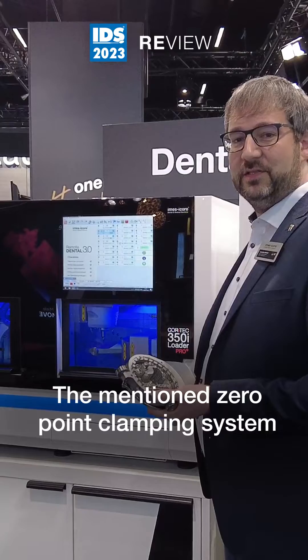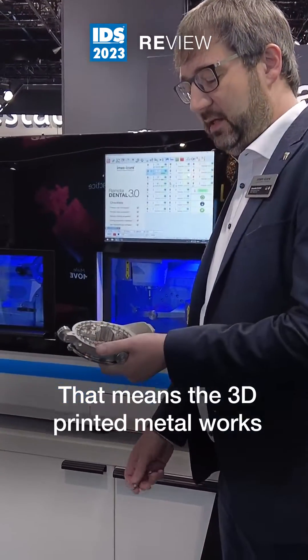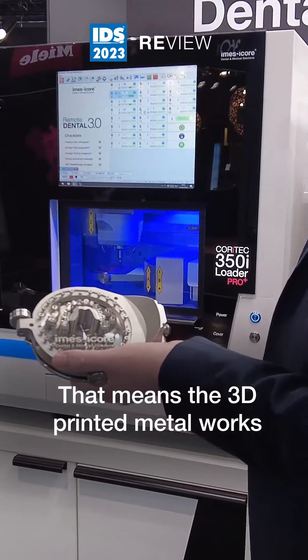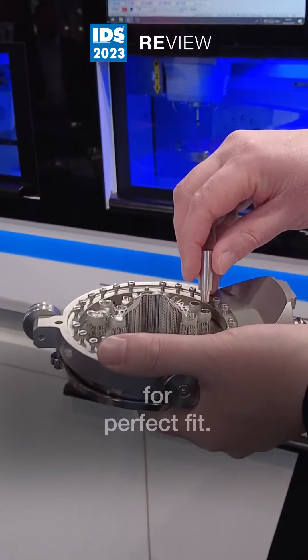The zero point clamping system also gives you the option for hybrid milling. That means 3D printed metal works can be remilled in a defined area for a perfect fit.